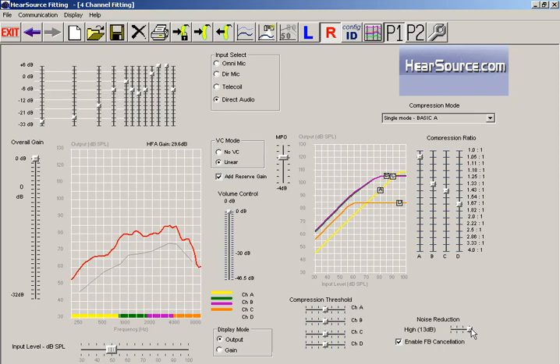Also, by using the noise reduction, this cleans up noise that might be embedded within the speech signal. Since the hearing aid can detect the difference between what is speech and what is noise, the speech will be cleaned up and heard a bit better even in the presence of noise.